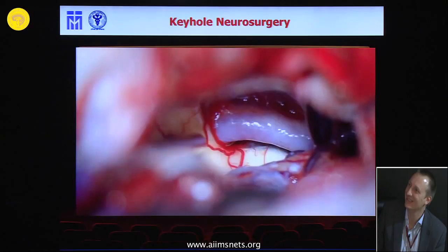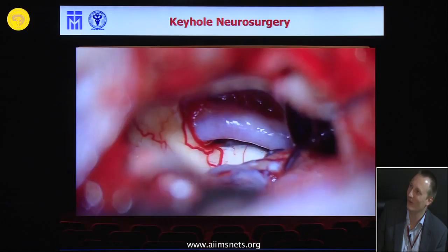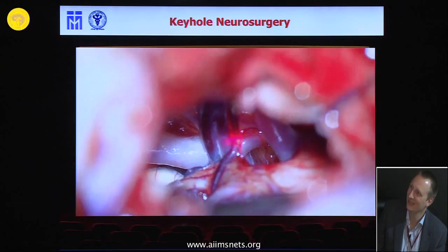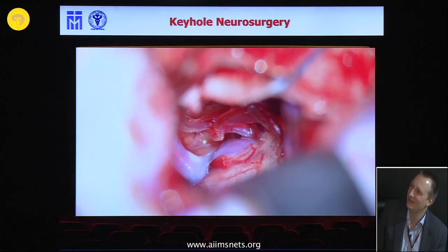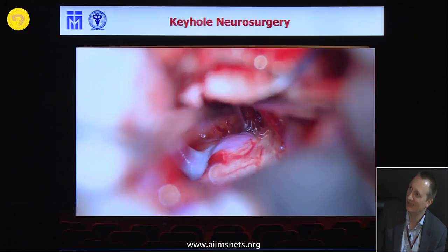You can see you have a nice exposure — it's not that you have no room to work. But you have to take time for CSF release, take your time for the arachnoid dissection, and then you see the aneurysm. You are able to split the Sylvian fissure from a reverse approach.